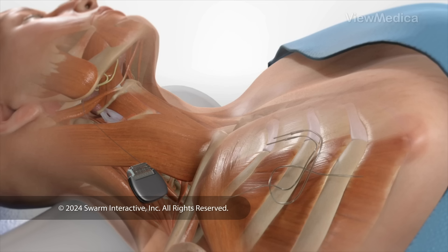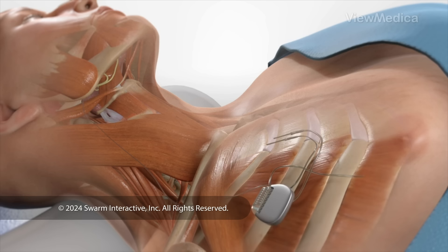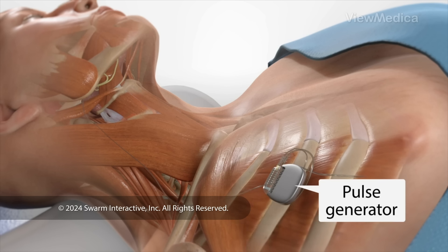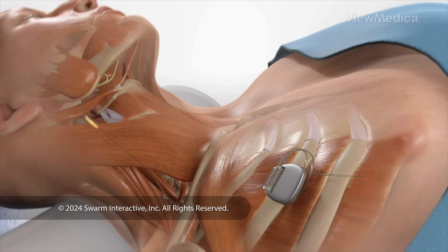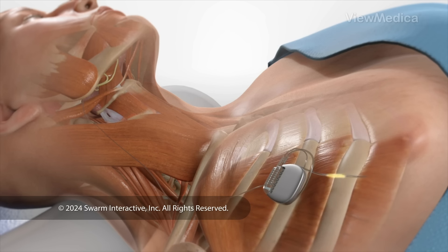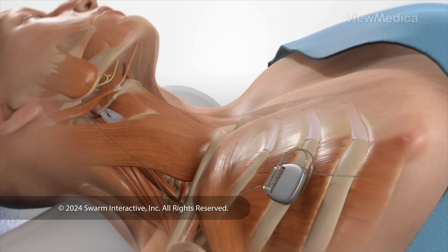The third part of the device is the pulse generator. We place it through a small cut near your collarbone and connect the two leads to it. You will control the pulse generator with a handheld remote, and you can set it so it turns on when you fall asleep.